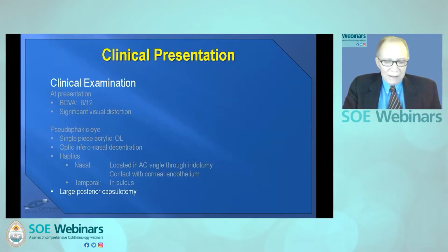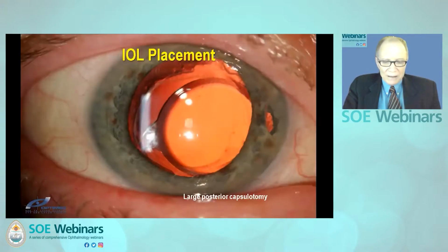A large diameter posterior capsulotomy was present without signs of vitreous in the anterior chamber. The posterior segment was intact. An endothelial cell count of the left eye totaled 2,600 cells per square millimeter. Even though the cornea was clinically clear, it was not possible to perform a reliable cell count on the right eye. There were signs of polymegathism of the endothelium on slit lamp evaluation.